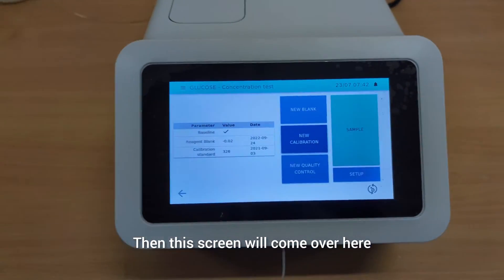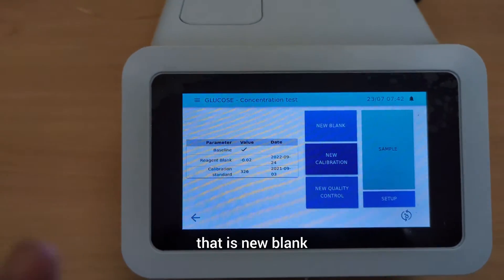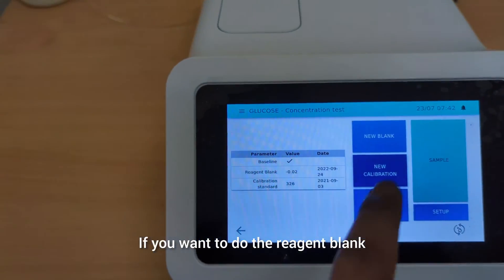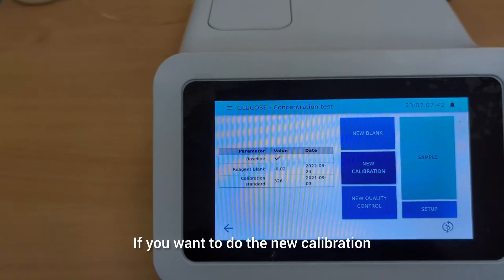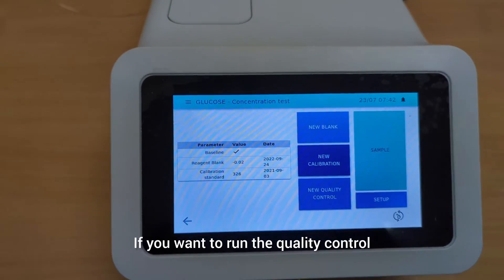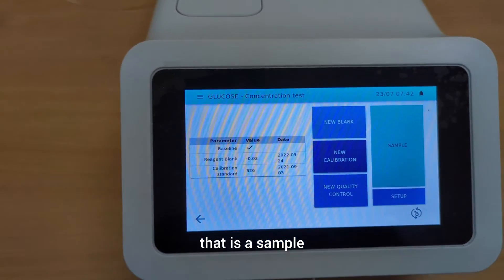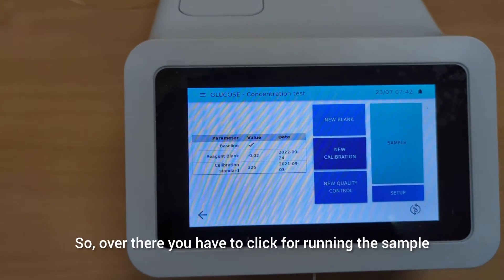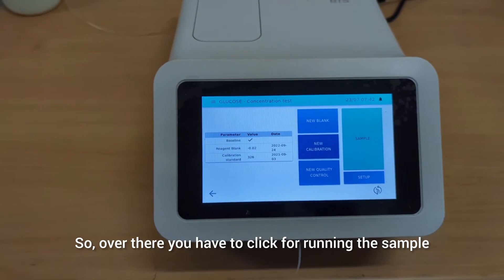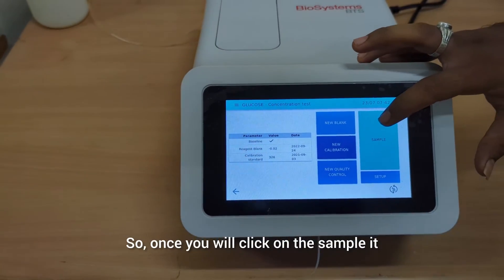After the baseline reading, a screen will appear with multiple options: new blank if you want to do a reagent blank, new calibration if you want to do a new calibration, new quality control if you want to run quality control, and then there is a main heading labeled sample — that is where you click to run the sample.